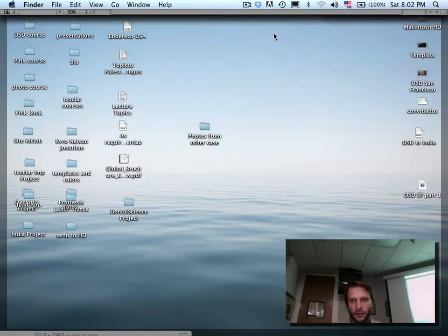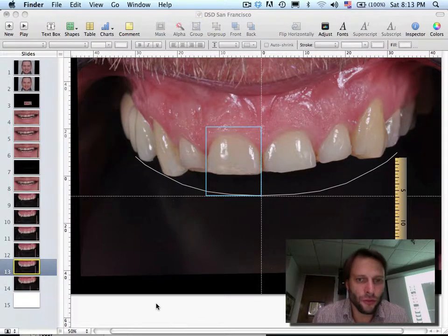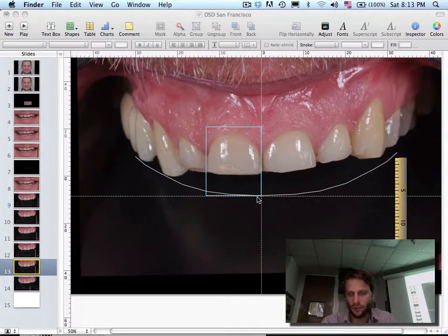I will save it, and this is something that I like to do because it gives you some nice inputs here. Let's say I want to play with this proportion here, and there is this kind of gingivoplasty that needs to be done. It's always nice to probe the anteriors, the buccal, to see if you can easily do that or not. So if I have a case like this, that has this bruxism, he probably had an abrasion, and the teeth extruded, bringing the tissue together, maybe not bringing the bone.